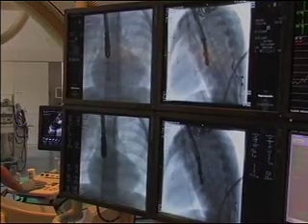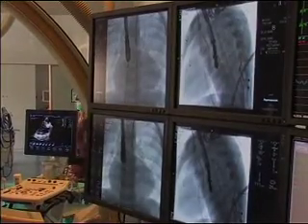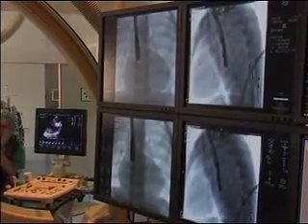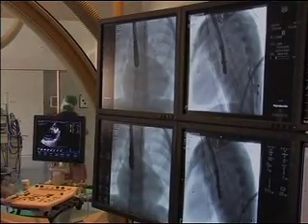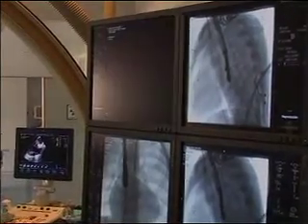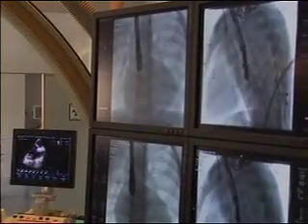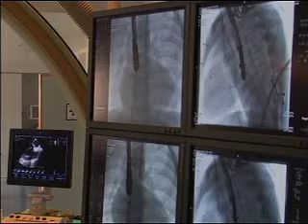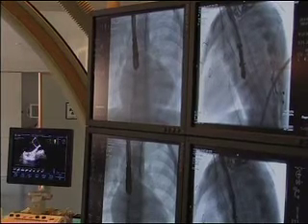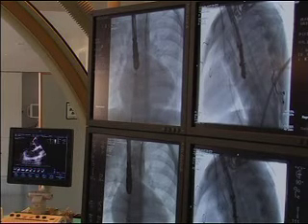So, you can see the tenting there, and I'll see the fluoroscopy in plane A and on plane B, on lateral. On lateral, I feel much more comfortable with the location because it's far away from the aorta, not in the anteroposterior. And I like the tenting there too. What do you think about the place? I think the echo looks encouraging, doesn't it? That it's distant from the other defect and there's a good bit of tenting. Yes.